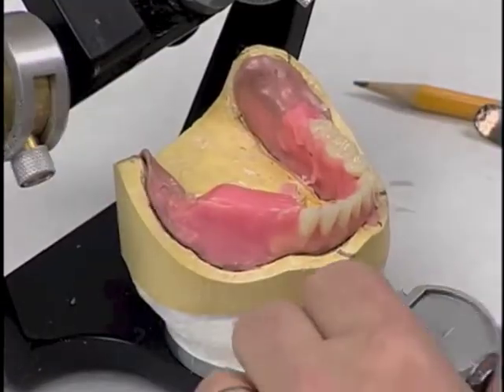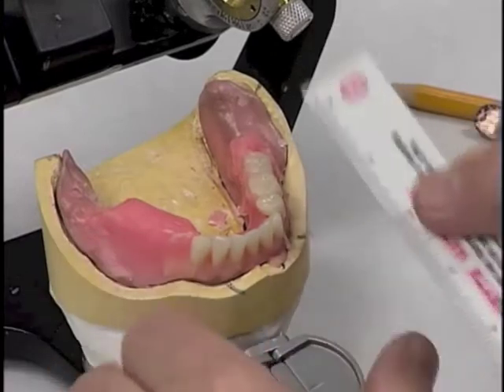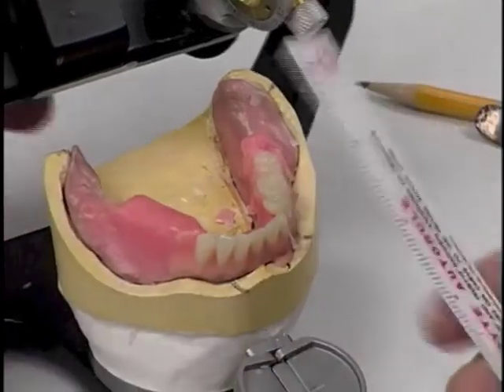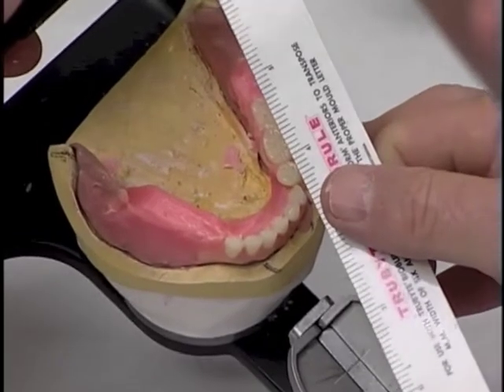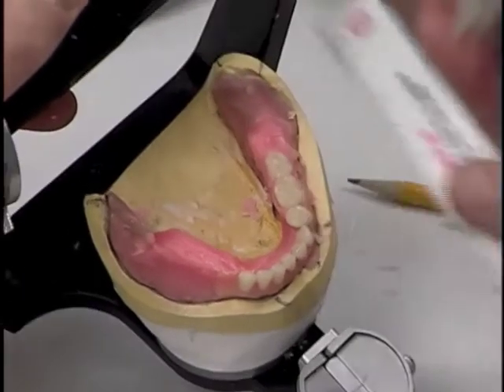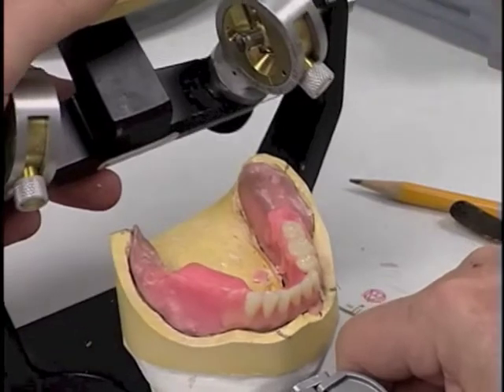Before we go to the other side, though, let's check on ourselves. Let's see if the central grooves of these posterior teeth are roughly directly over the crest of the ridge. And we do that by placing the straight edge between the marks and see where they are, and yes, they do turn out pretty good. Those central grooves are directly over the crest of the ridge.